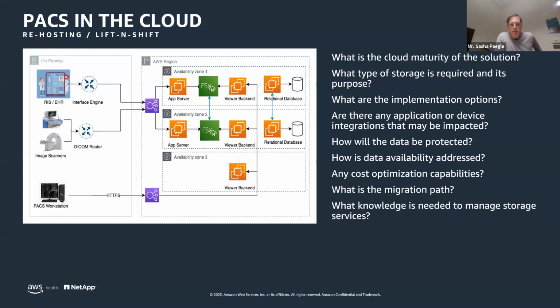Yeah, sure. So just jumping through that, we're going to dive into three different examples just to be able to go through those 5 criteria that we just talked about. So let's imagine with AHI Memorial Hospital, their particular imaging ISV comes forward and says, hey, we think we can deliver a production PACS system in the cloud. And they actually share this architecture diagram. The architecture is outlining all the different services and components to deliver that PACS solution.